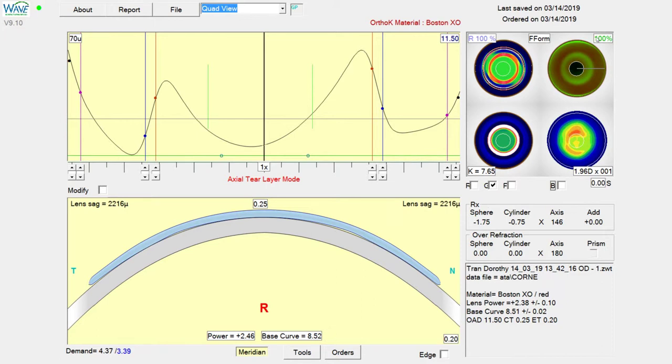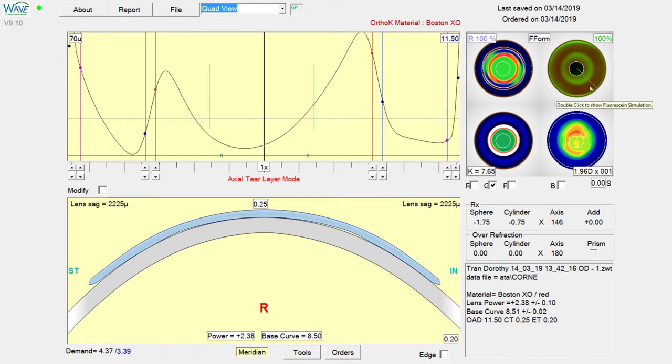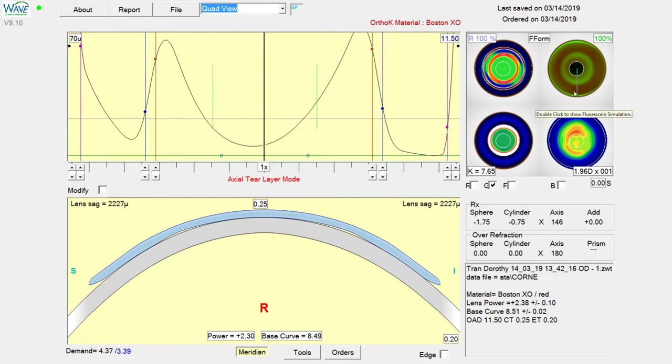Now we also made this change in 100% mode, which implies that it should be throughout the entire treatment zone of the lens. But sometimes the software is not entirely accurate, so it is good to click through the different meridians and see if there's any variability. It's not huge but we do have a little bit.